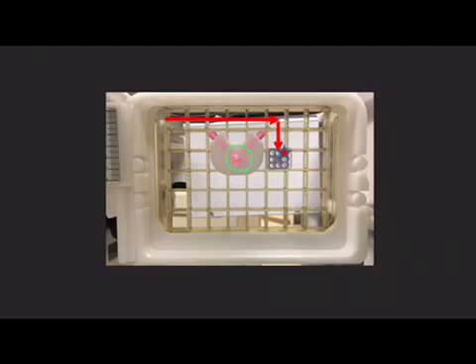I'm going to have a technologist or resident reading over my shoulder and I'm going to say my fiducial is in 1, 2, 3, 4 from the patient's head, 1, 2, 3 from their chest. I'm then going to do the same where I put my marker block in and say I'm going to go in this case 1, 2, 3, 4, 5, 6 from the patient's head, 1, 2, 3 from their chest and place my marker block there. I'm going to go in the top right-hand corner.